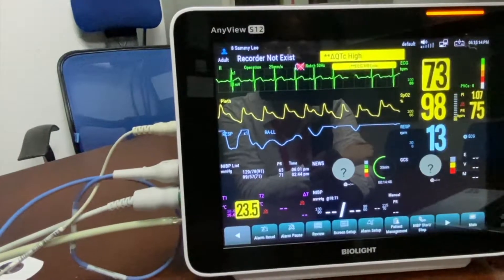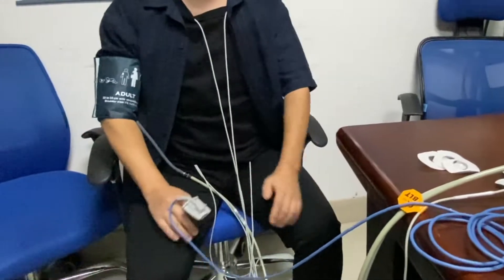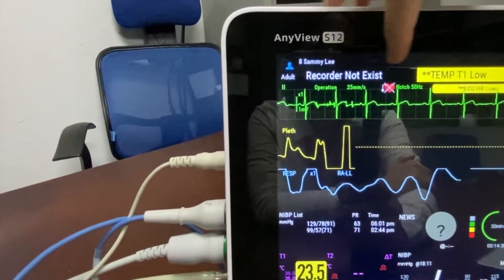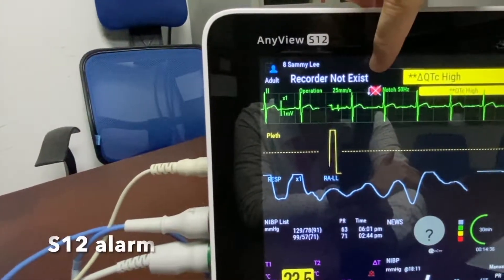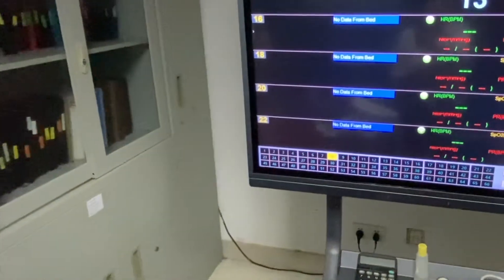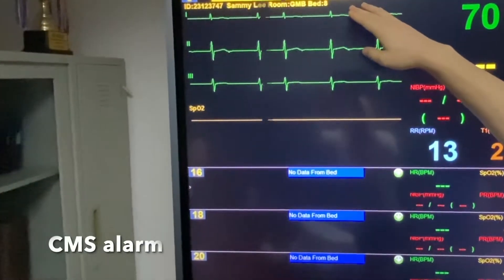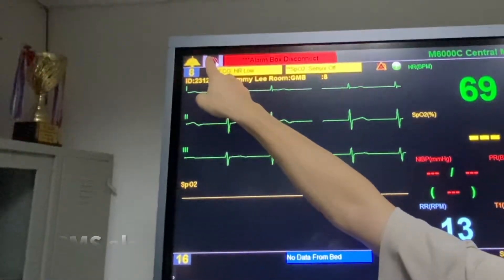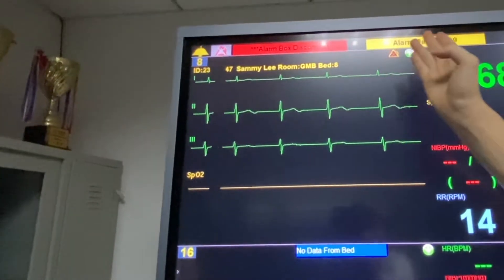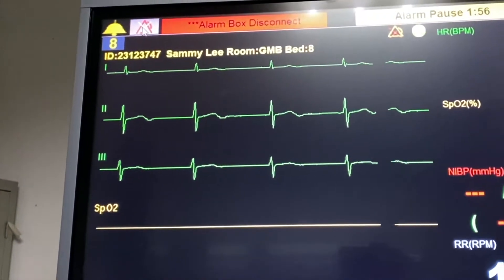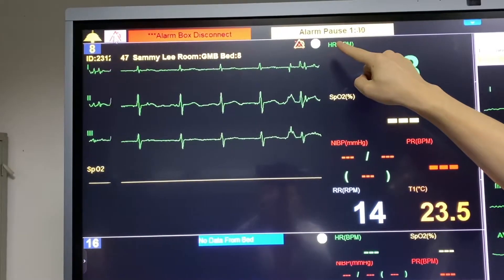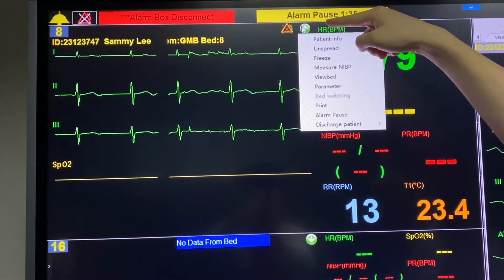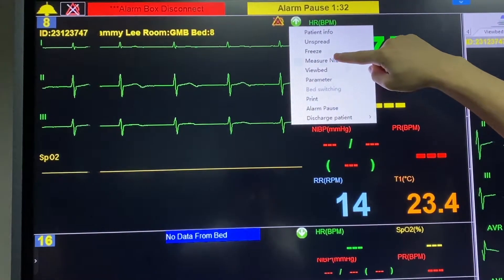Currently we are measuring the patient's SPO2 level. If the patient accidentally disconnects the probe, the machine will alarm 'SPO2 sensor off', and on the CMS we will see the SPO2 sensor off notification in real time. If I want to suspend the alarm, I'm able to operate on the CMS to suspend the alarm for two minutes. Also, if I want to remotely check the patient's blood pressure, I can click onto the arrow to press the button and measure NIBP.